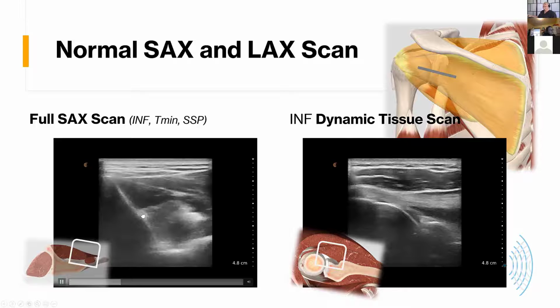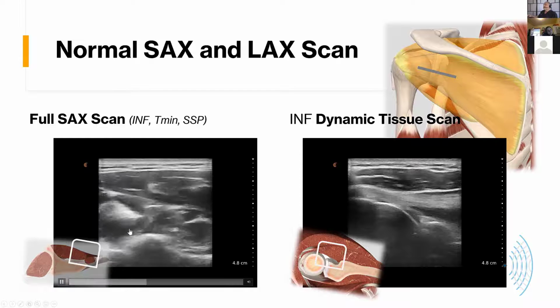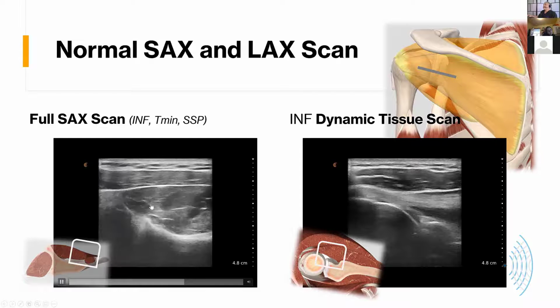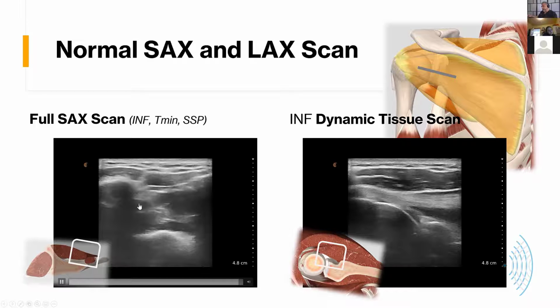And watch as I follow that infraspinatus all the way up to where it becomes a tendon. So we're getting close to the head of the humerus. And that infraspinatus is just about ready to become entirely tendon as we get to the head of the humerus and going on to the middle facet. We're going to keep going here. I think I might go up and over, and it becomes the supraspinatus. Yes. And look at that. Look at the quality of this meat. It's like elk meat, how we don't have much fatty infiltration there. And again, above it, we have the upper trapezius musculature right there.